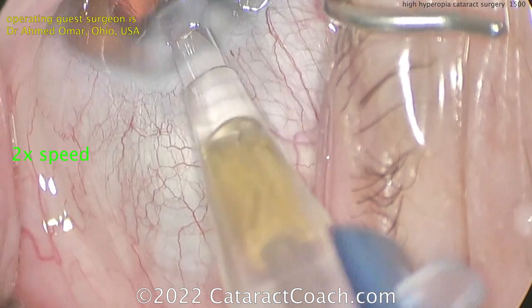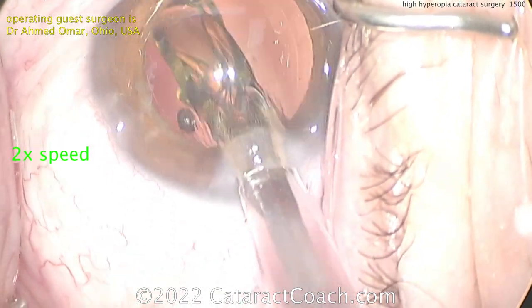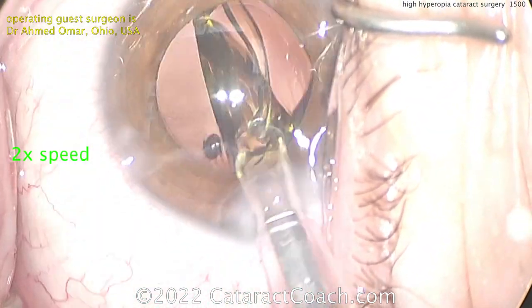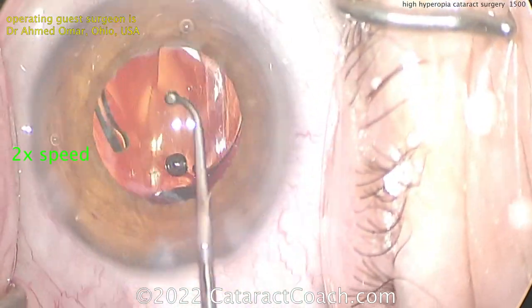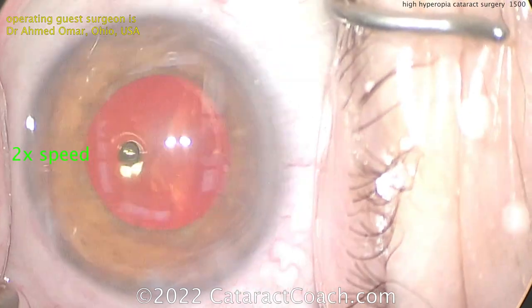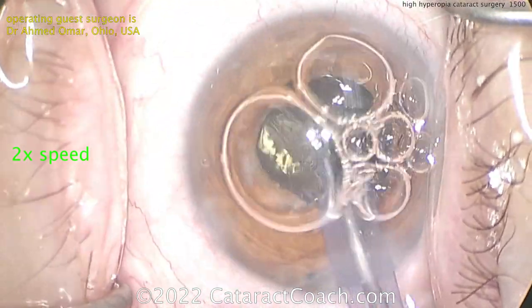Here comes the new lens going into the capsular bag — a single-piece acrylic lens. Remember, this lens is thicker; a 32 diopter lens is going to require a bigger incision and a thicker cartridge. When this goes in the eye, remember the 7L rule: the leading haptic like the number 7, the trailing haptic like the capital letter L. That looks great. Look at the rhexis size — just about perfect. That 6mm lens looks pretty massive in this eye because the eye is tiny with a small white-to-white, but it goes in very nicely.